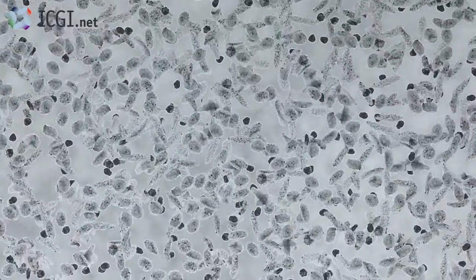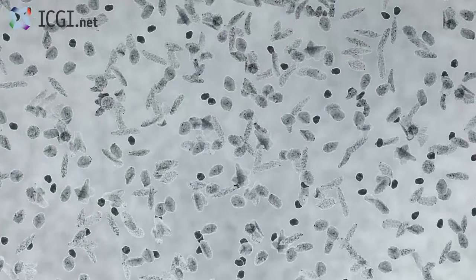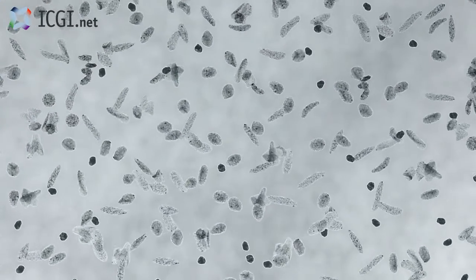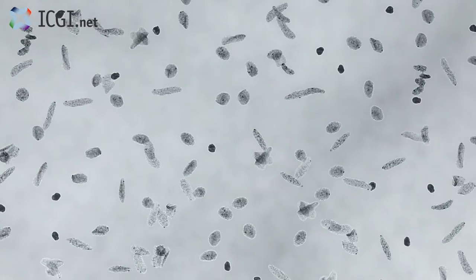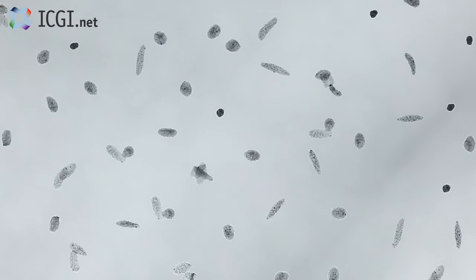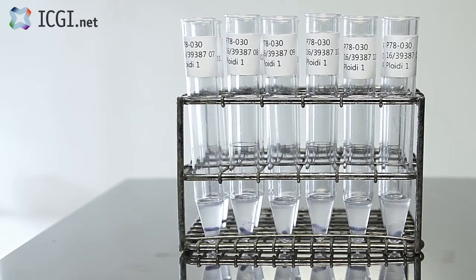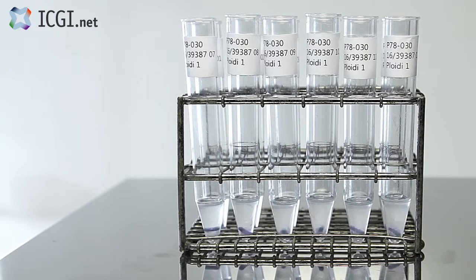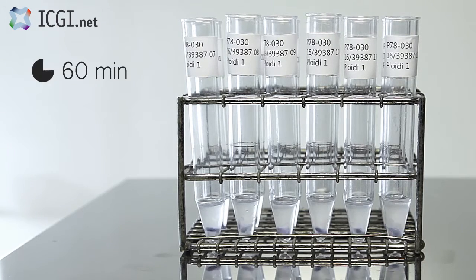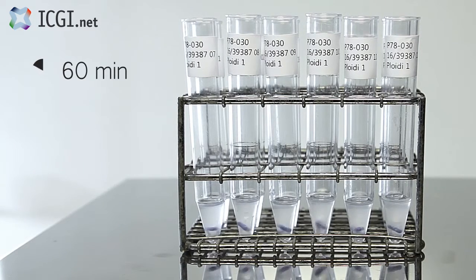Here we see the liberation of single nuclei through enzymatic digestion and mechanical disruption of the tissue. Fresh enzymatic solution is made by dissolving proteinase type 8 in PBS, and mechanical disruption is performed by magnetic stirring bars. 1 milliliter of enzyme solution and 1 magnetic stirring bar are added to the tissue and placed on a magnetic stirrer. Tissue disruption is performed at room temperature for 60 to 75 minutes, depending on the tissue type.